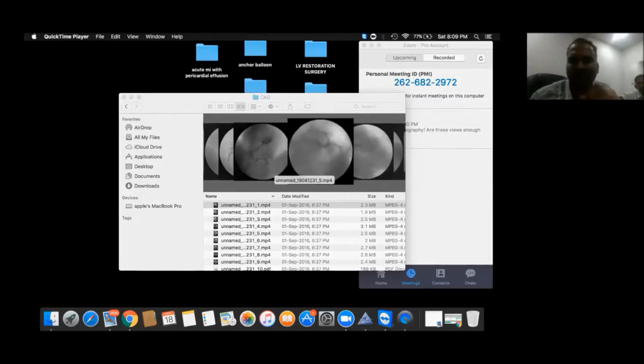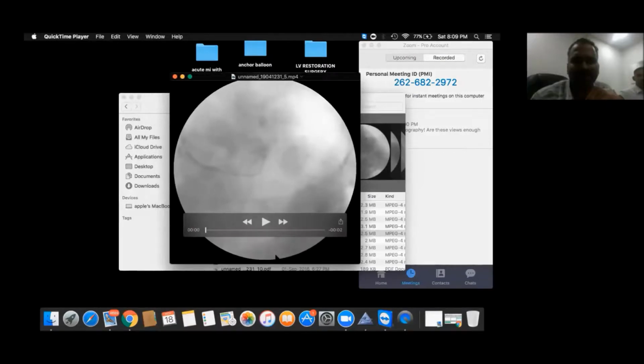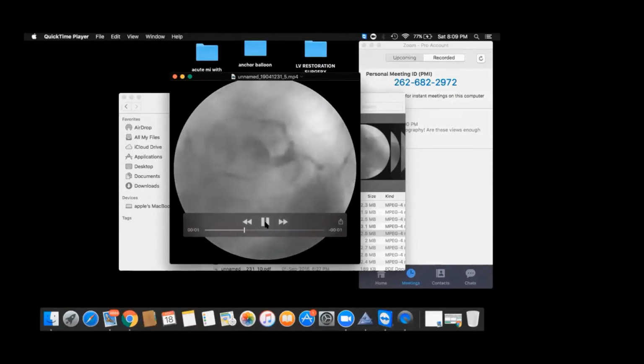The important point in this case is the LMCA. Sridhar, you can comment on the LMCA. Already there is a lesion, I'm not bothered about it. Just comment on the LMCA. Obviously it is not engaged properly, but you can see some haziness. Contrast opacification is different at the ostium when compared to mid and distal LM. So I think I need a few different views to profile the ostium of the LM.